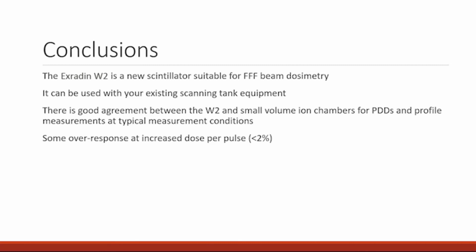Sure. I think the real underlying issue there might be if the Cherenkov spectrum changes based on those other dose rates, then that might have an impact on things. But something to look at in the future, I guess. Another question is whether you saw any decrease in the blue signal after longer irradiation times. Is that something that you observed?